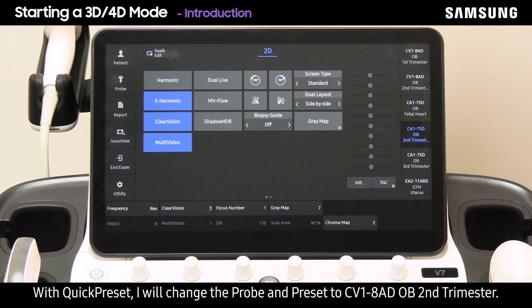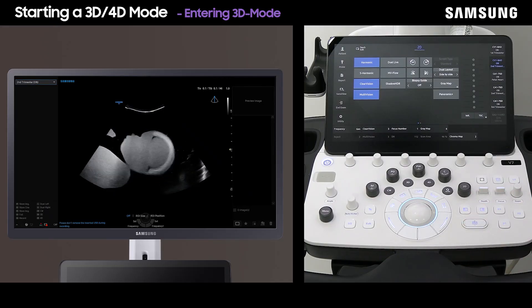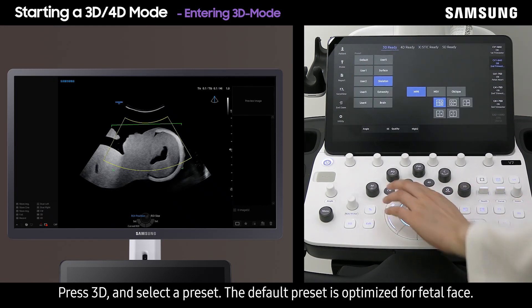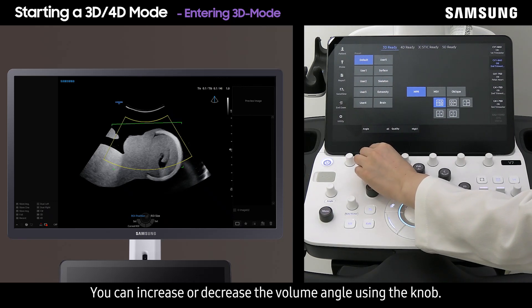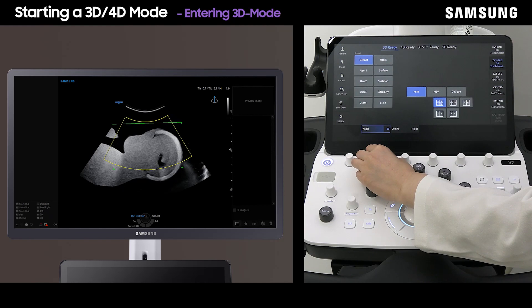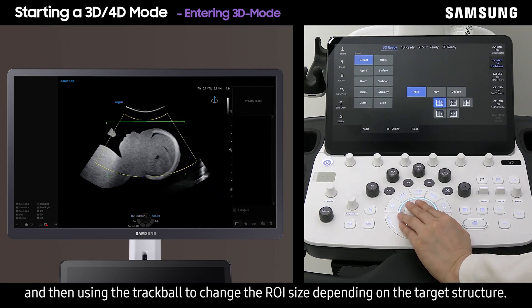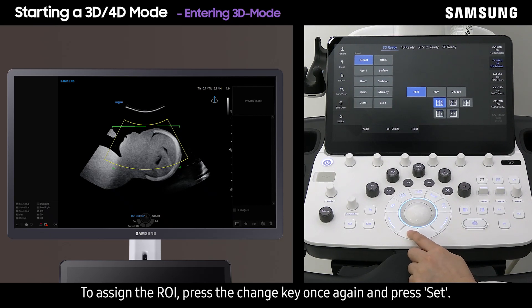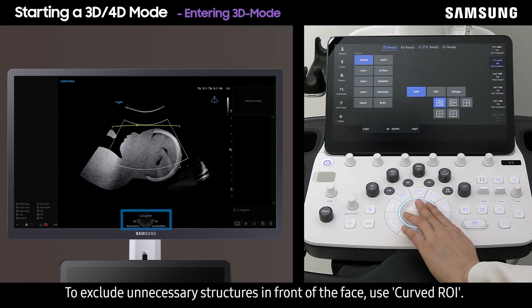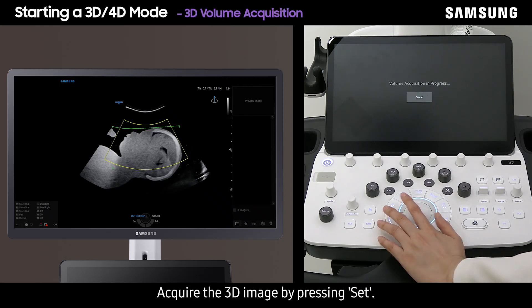For the 3D/4D demonstration, with quick preset I will change the probe and preset to CV1-8 AD OB second trimester. Press 3D and select a preset — the default preset is optimized for fetal face. The 3D ROI will appear; you can increase or decrease the volume angle using the knob. The 3D ROI can be modified by pressing the change key and using the trackball to change the ROI size depending on the target structure. Press the change key once again and press set to assign the ROI. To exclude unnecessary structures in front of the face, use curved ROI, then acquire the 3D image by pressing set.